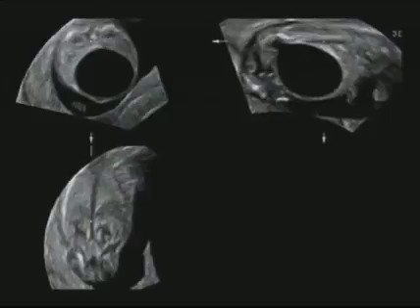And one last example, this is a fetus that has urinary obstruction. It has posterior urethral valves. And you can see the very, very large bladder that this fetus has. You can see the posterior urethra. And in this case, actually, you can also display the kidneys. And you can see our little dot right here, our dot right there is on the descending aorta. And so that's what all of these three images have in common, is this one dot.